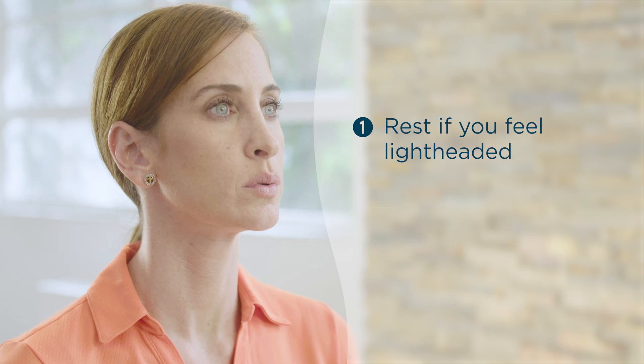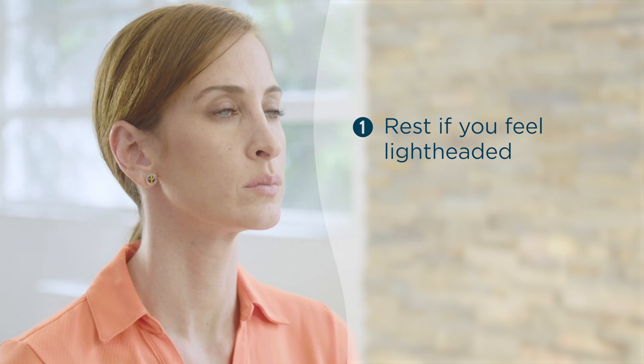Exhale through pursed lips as you are breathing normally until the lightheadedness subsides. If the feeling persists, stop and contact your care provider. You are welcome to contact us as well.